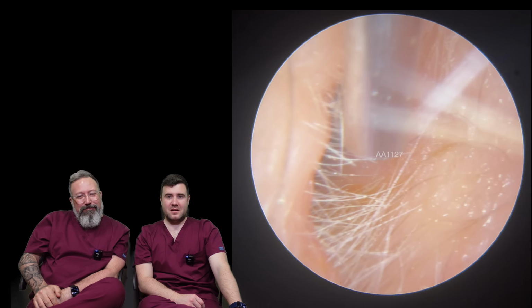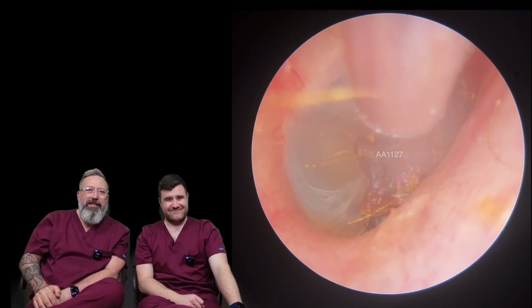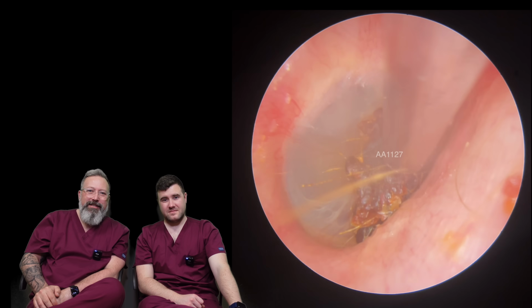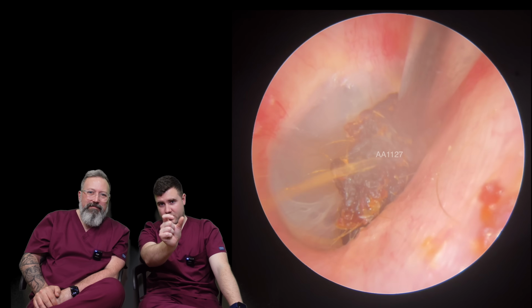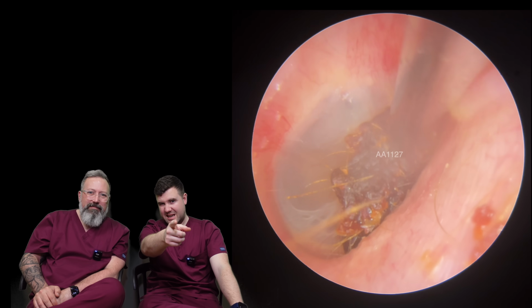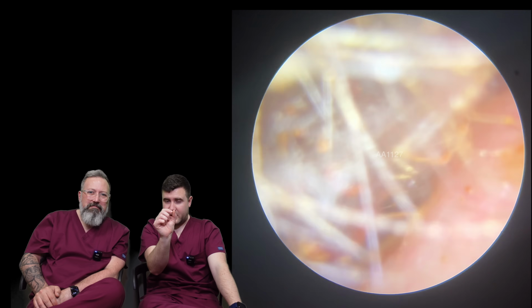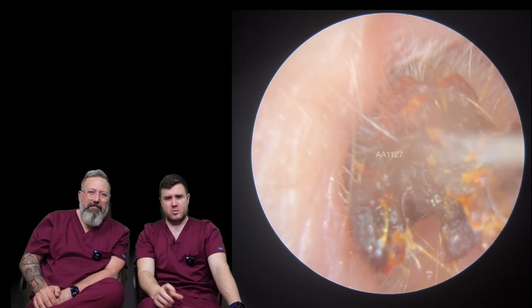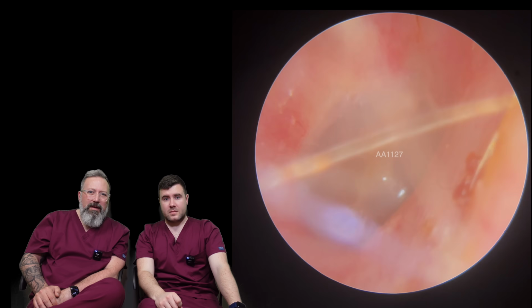There we are. Last little bit now. Now this is right down in our anterior recess. Is this going to come away well? This is the key point. You can see where we've taken those little dry pieces, there are little patches of inflammation where that wax has been attached to the ear canal. Super dry as well. There's no oil that's been used in this one. There you go. There we are.